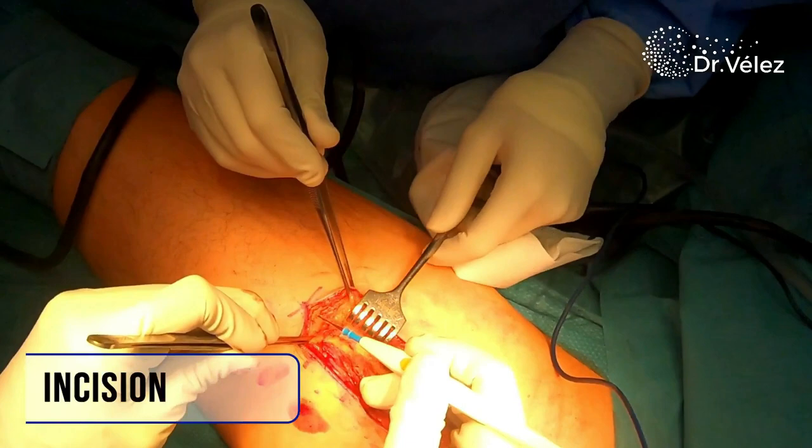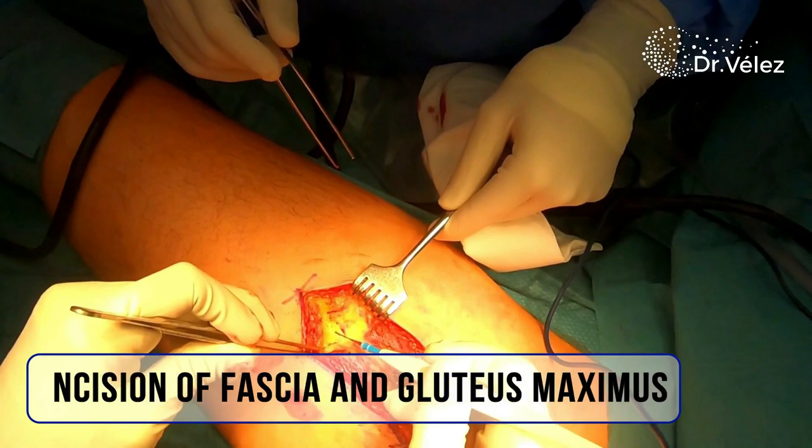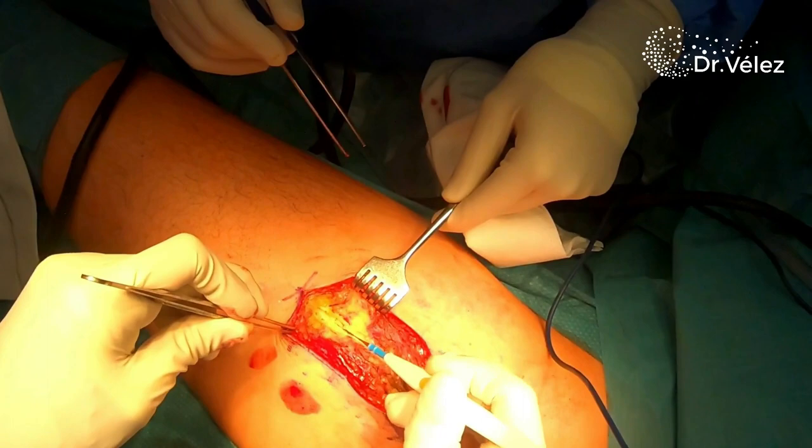So after incising over subcutaneous fat, we arrive to the fascia. I prefer to directly open the fascia with electrocautery.